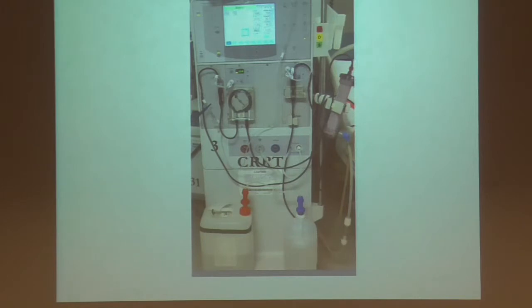But before they had the addition of this blood roller pump, I remember George talked about injecting phenylephrine or vasopressors into the blood circuit to raise the pressure right before it got to the machine and then off. So we had these patients, septic, dying, who would get on the machine, somehow make it through, get off, and then crash right after because they didn't have pressure support, they didn't have anything to maintain their blood flow rate. So I think we're pretty spoiled. I just walk up to a machine and casually dial up what I want for my blood flow rate, and it does it. The machines are very, very nice to work with.